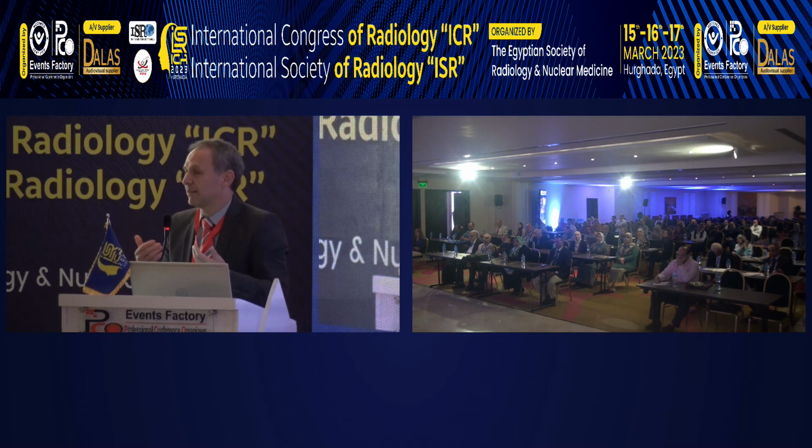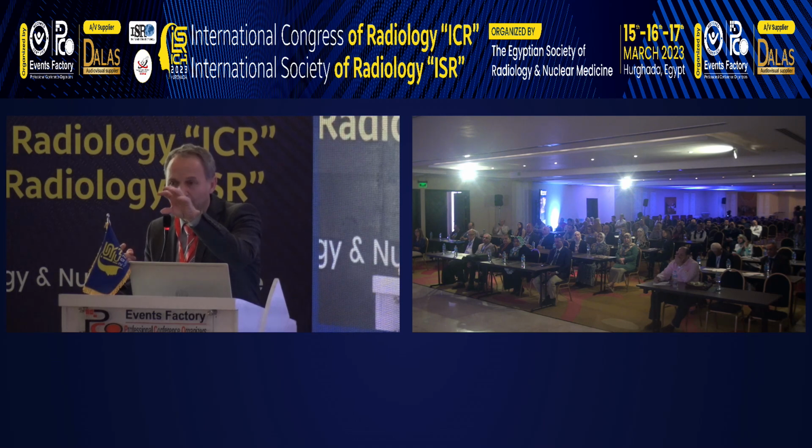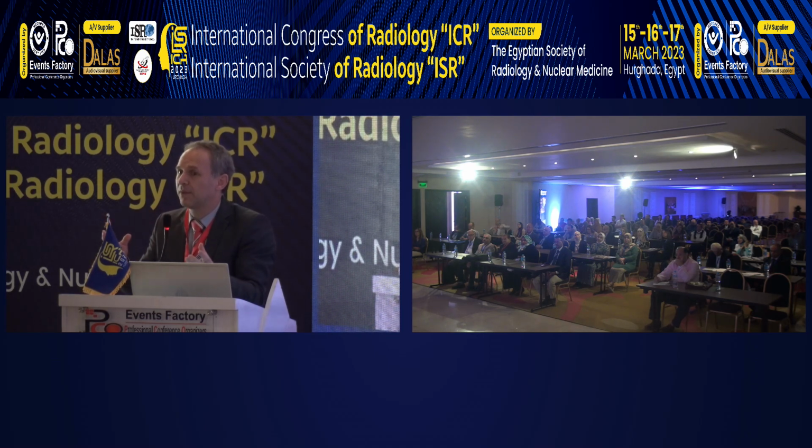In essence, in our service, we talk to every patient, not always before the scan, but always after the scan. We look whether we have the geographic distribution, and then we question the patient and see whether we go forward. Now, if this is impossible in the respective settings, you can still look at the topographic distribution with the appropriate structures involved, and don't question the patient, but put it in your report, suggesting.